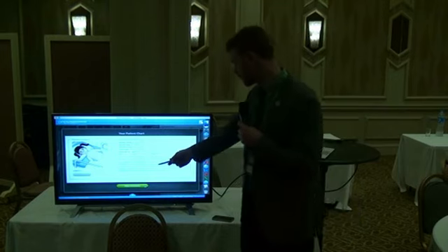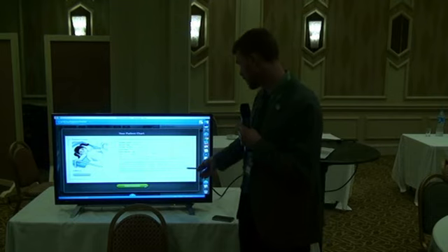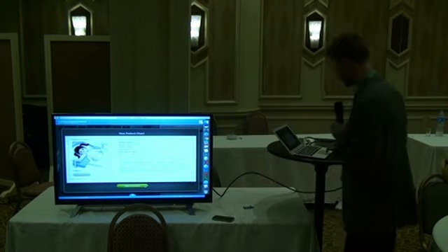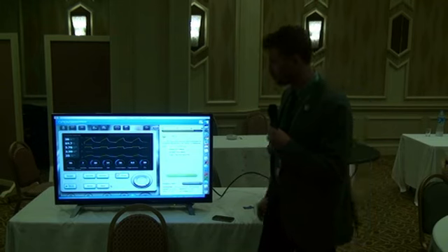She's been intubated for a number of days, and recently we're called over because the peak pressures increased, and oxygen saturations decreased, and the blood pressure has gone down. All right, so we're in volume control, SIMV plus pressure support, and I'm going to show you a couple different things about that.